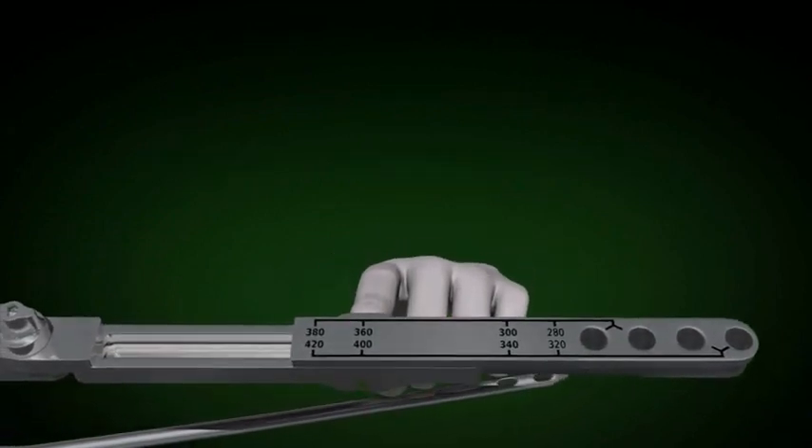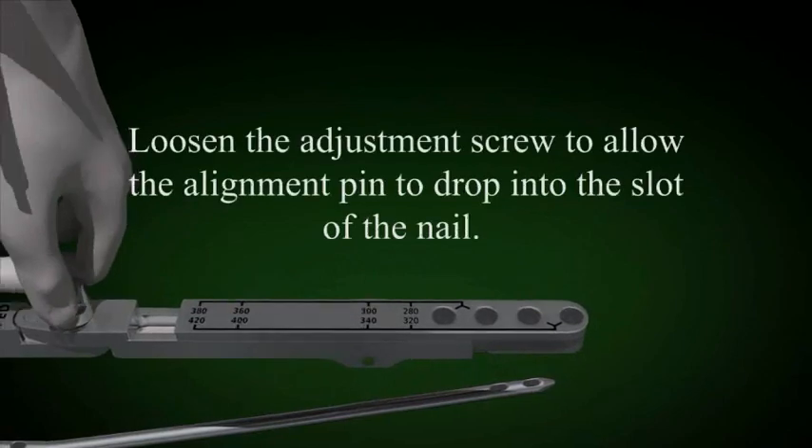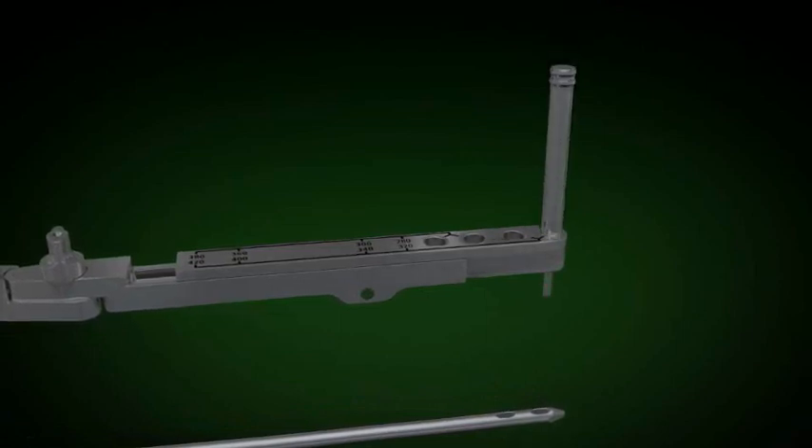A set screw, which does not show in this video, is used to stabilize the distal extension. The distal extension is then placed over the slot in the nail and the adjustment screw is tightened.